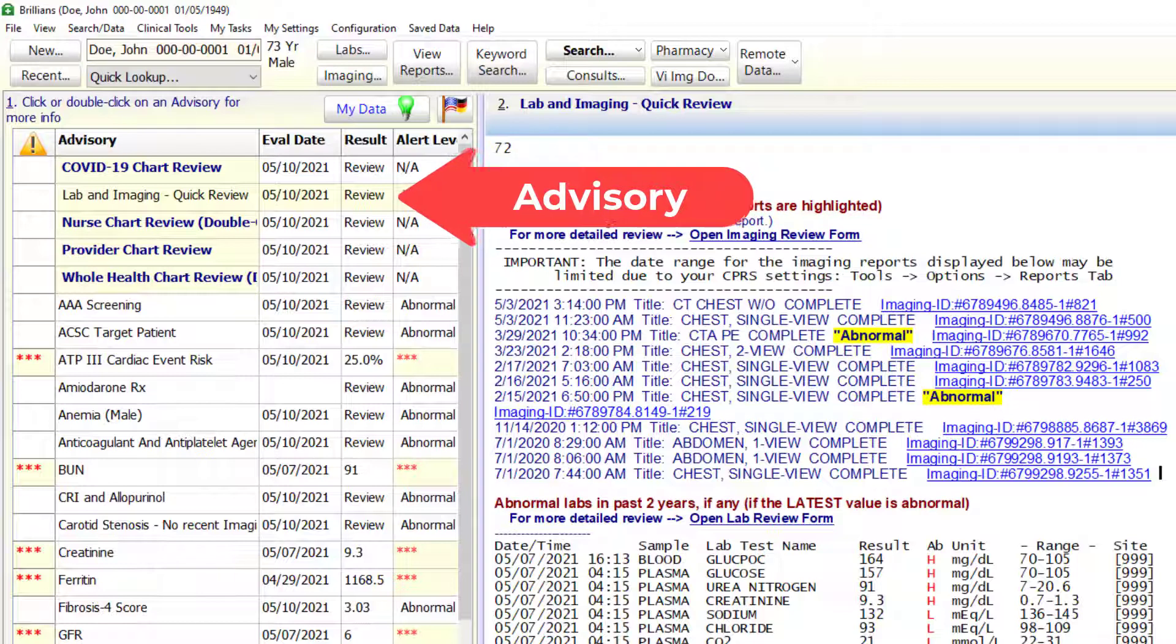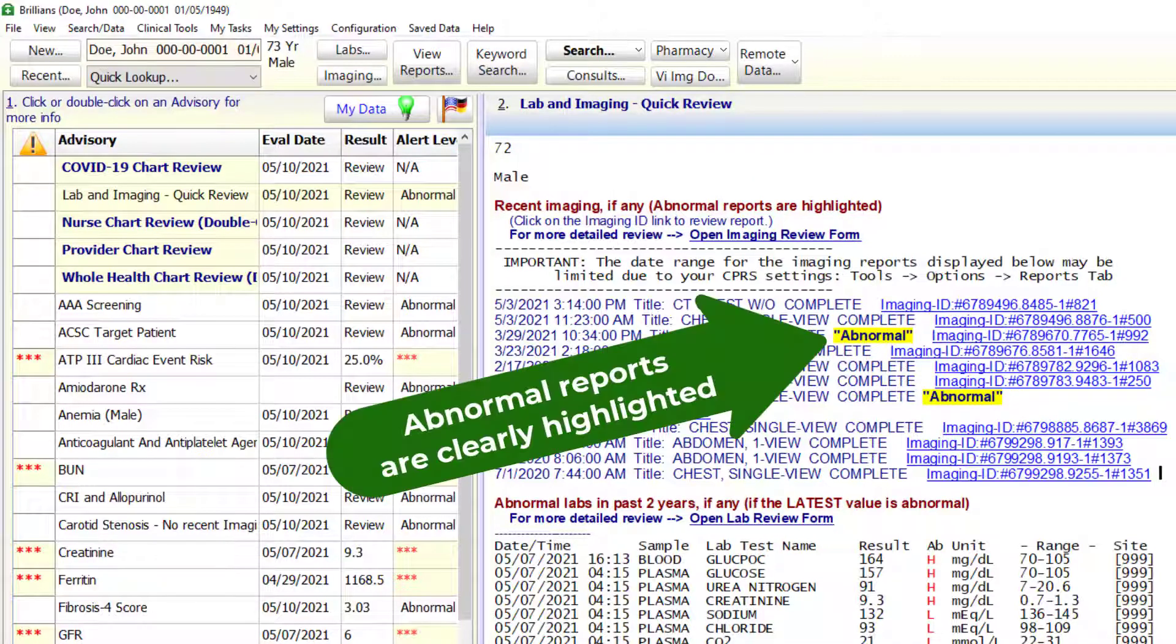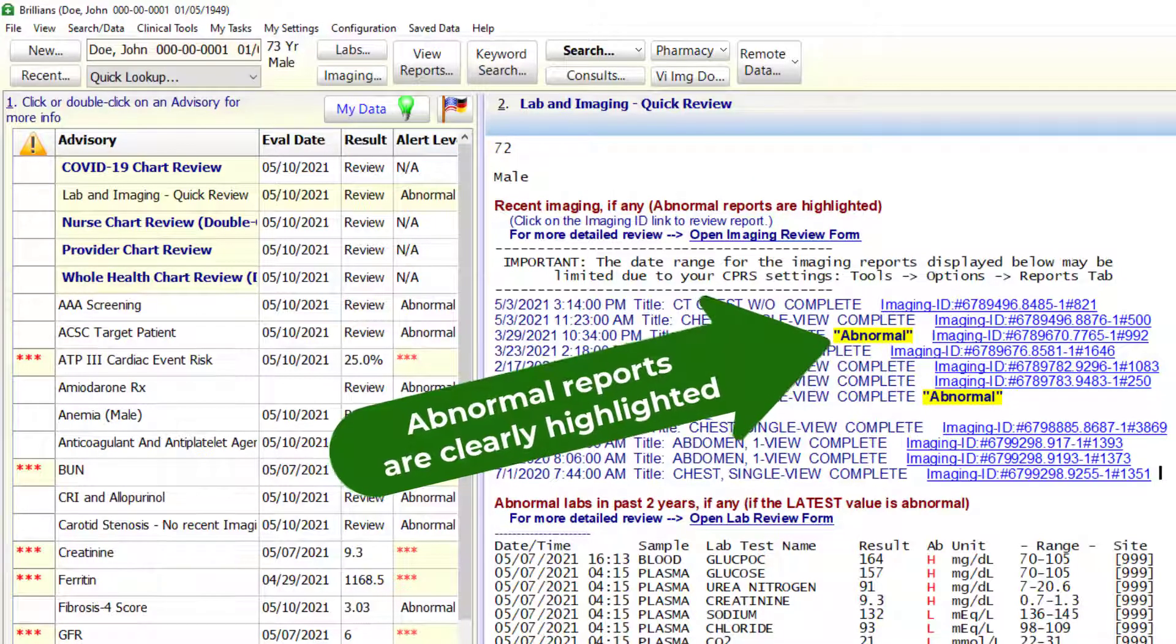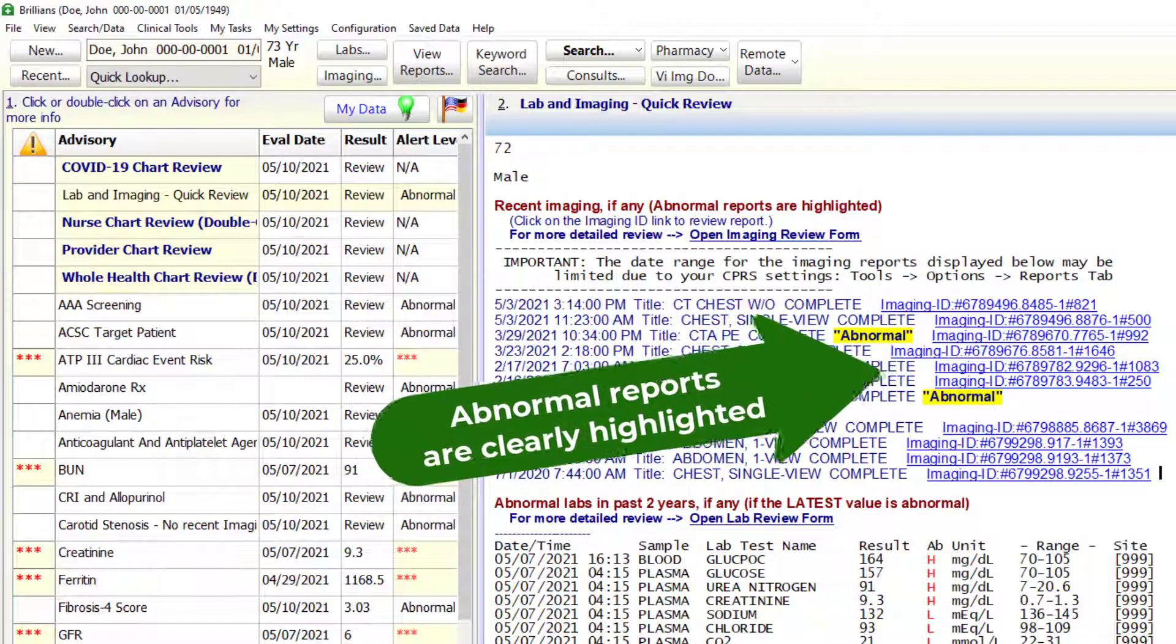One, the recent imaging reports are displayed via an advisory. The abnormal reports are clearly marked and can be reviewed with one click.